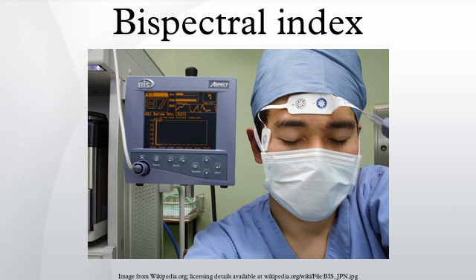The bispectral index is prone to artifacts. Some conscious patients who were administered neuromuscular blocking agents such as succinylcholine may have low bispectral index scores. Thus, the BIS may fail to detect consciousness in such patients. Its numbers cannot be relied upon in all situations, including brain death, circulatory arrest or hypothermia.